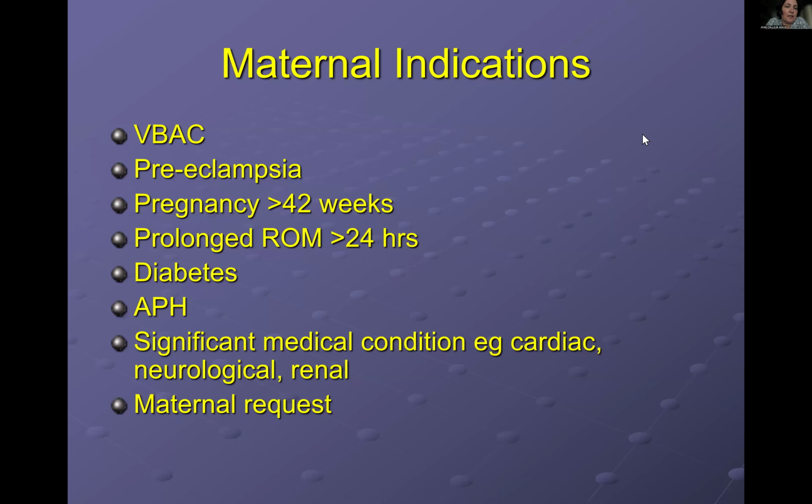Of course, if there are pregnancy-related complications like preeclampsia, if you are post-dates, like post 42 weeks, if there has been prolonged rupture of membranes of more than 24 hours, if the mother has diabetes, whether gestational or full-blown diabetes, if there has been antepartum hemorrhage, if the mother has significant medical conditions such as cardiac, neurological, or renal, and if the mother herself requests that she wants to be monitored.